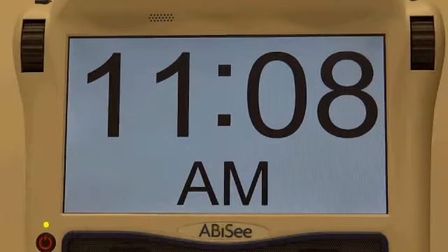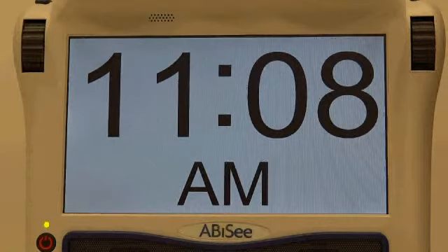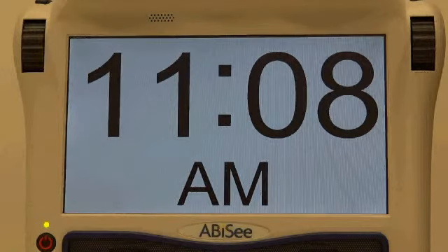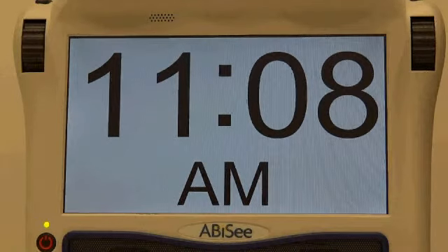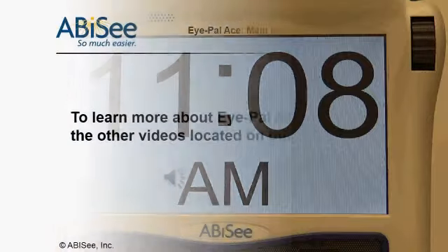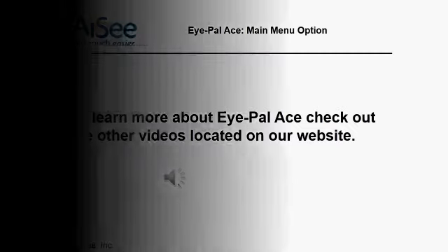If you prefer not to hear certain main menu options announced, you can disable the functions you do not want to use. To learn more about iPAL ACE, check out the other videos located on our website.